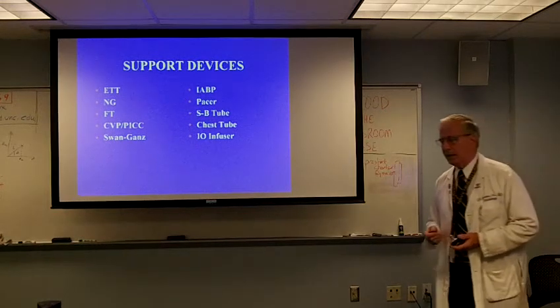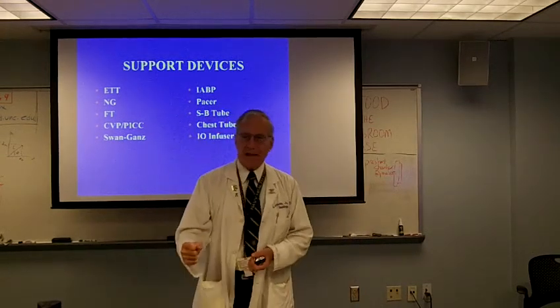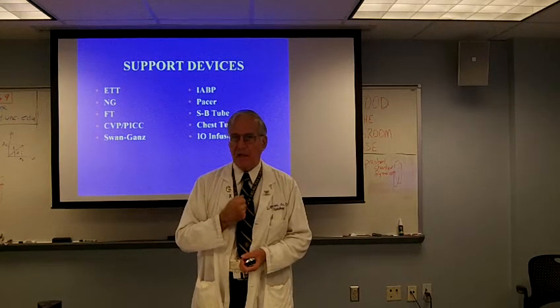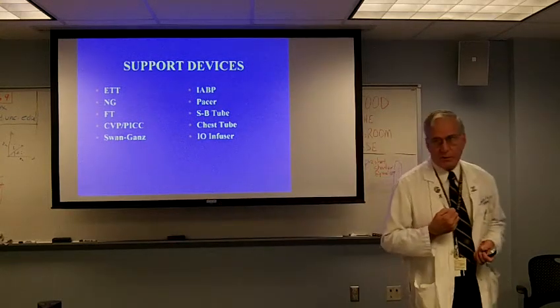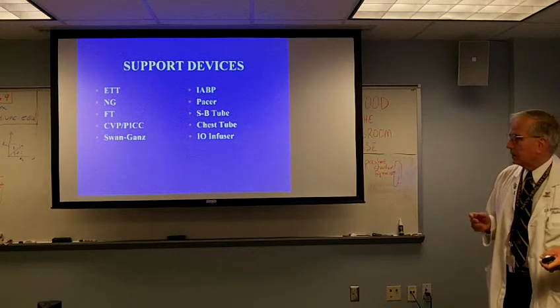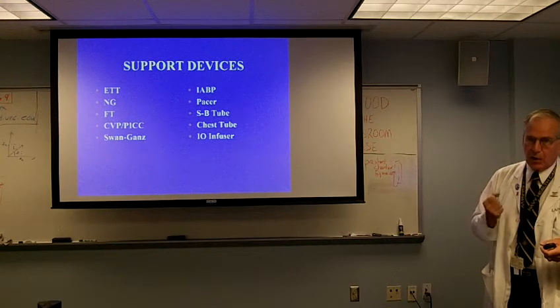But basically what it is designed to do is you take this device and with 70 pounds of force, you slam it into the sternum and it goes through the anterior cortical table into the marrow space of the sternum, and it allows you to rapidly infuse fluids for resuscitation. The problem is if you've got a really big patient with a lot of adipose tissue anterior to the sternum, those prongs are not long enough to get into the sternum.